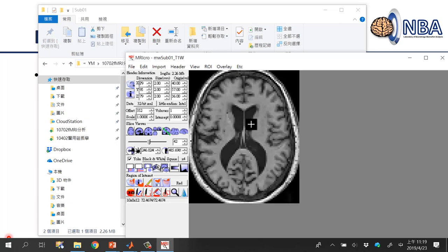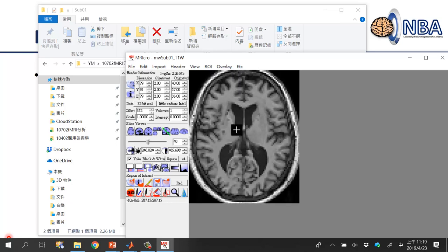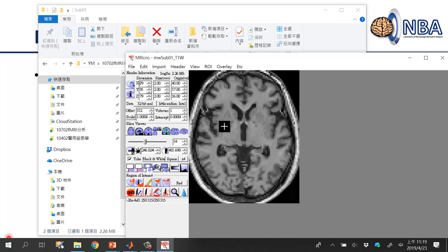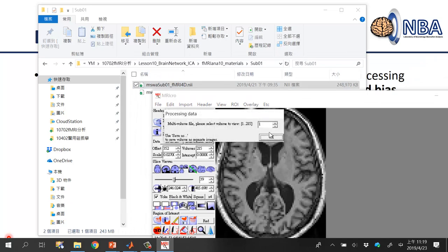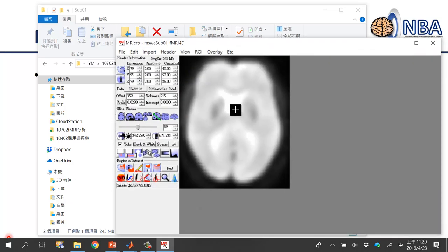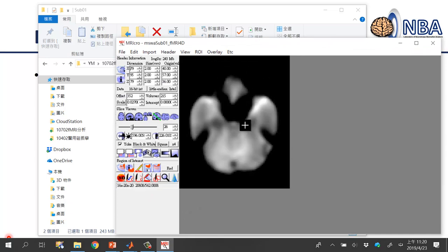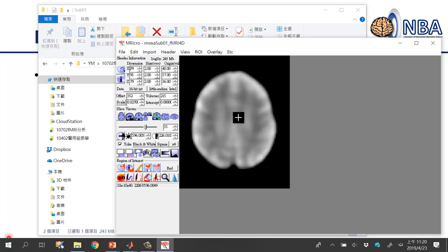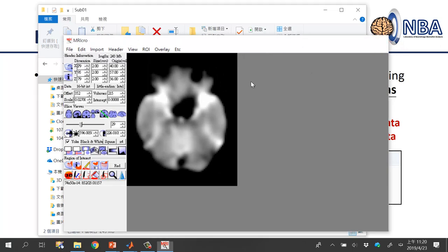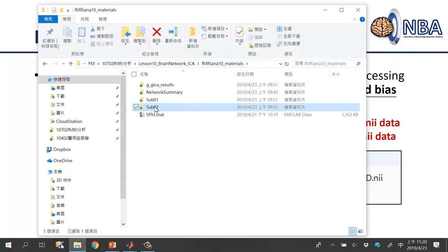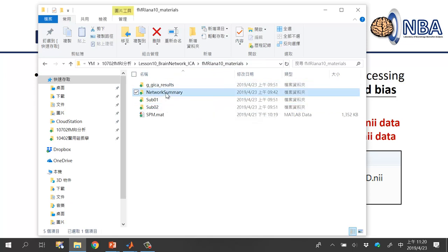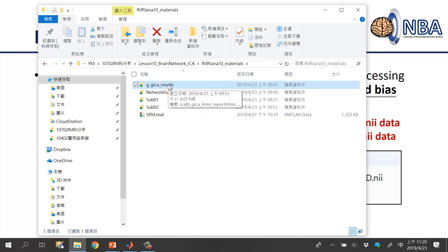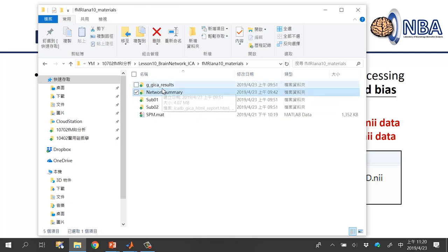The dataset I provided is from stroke patients — you can see lesions in subcortical regions, likely in the putamen. The fMRI dataset has 215 time points, and imaging homogeneity is good because bias correction has already been performed. Sub02 contains similar data for the second subject.